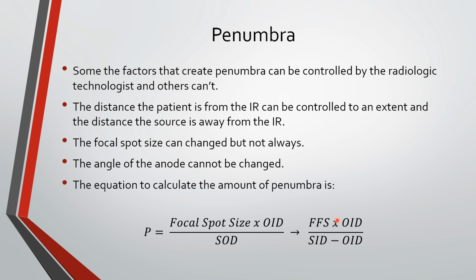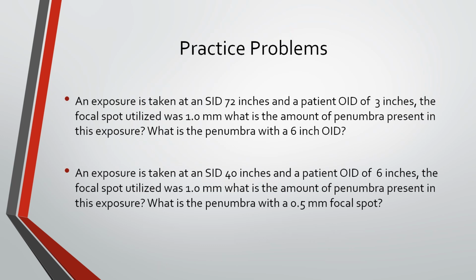And as the SID becomes shorter, this becomes more pronounced, as we talked about with the hand before. Let's go ahead. There's a couple practice problems right here. You can pause the video here. I encourage you to solve these problems based on the last slide. You can go back if you didn't quite get that equation.